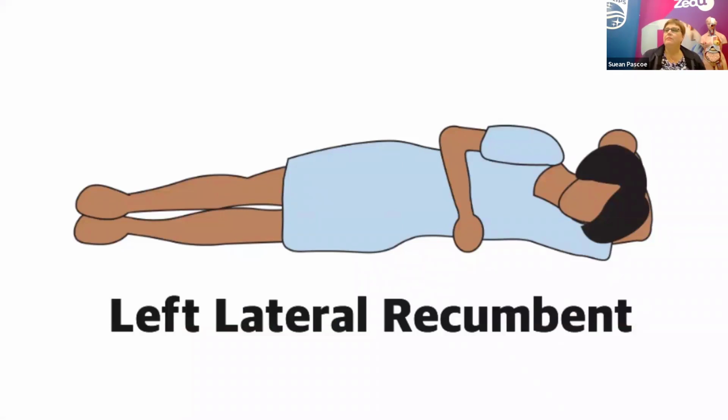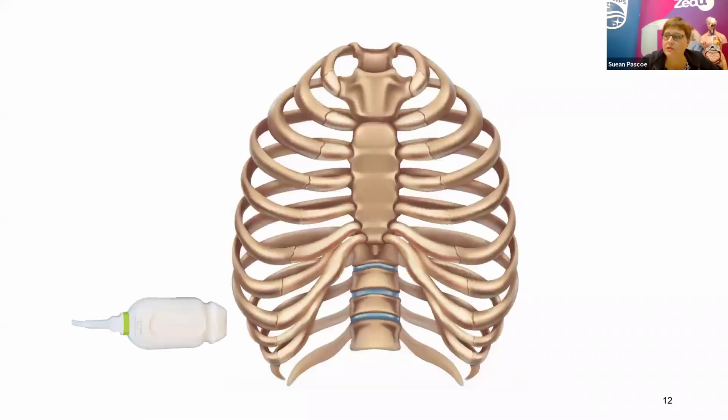The other big tip that I'd say is straight up, don't muck around with it. Get your patient on their left side as soon as you can. This just lets the liver drop out from behind the ribs just enough so that we can get a slightly better window on it. I also get the patient to take a big breath in and hold their breath. This pushes the liver down from out behind the rib cage. And when all else fails, try an intercostal approach. Sometimes it can work, sometimes it doesn't even help at all, but it's always worth giving it a crack.